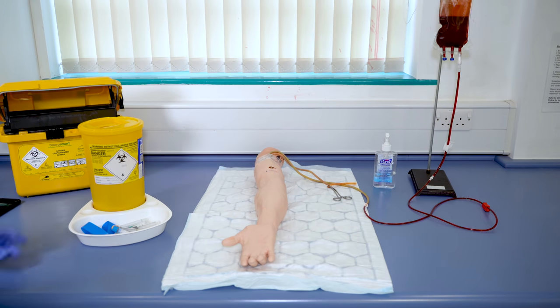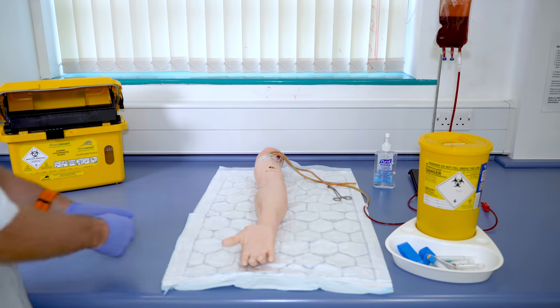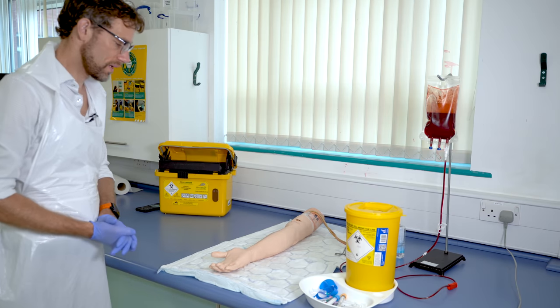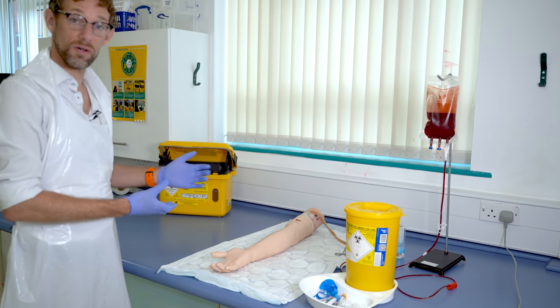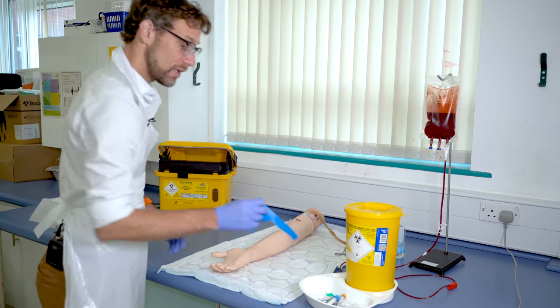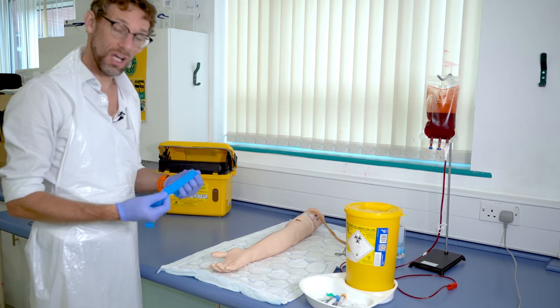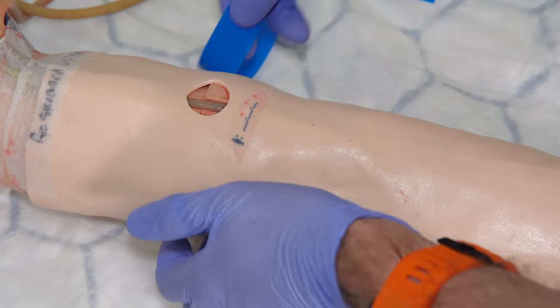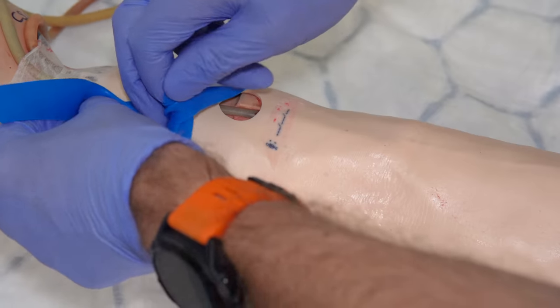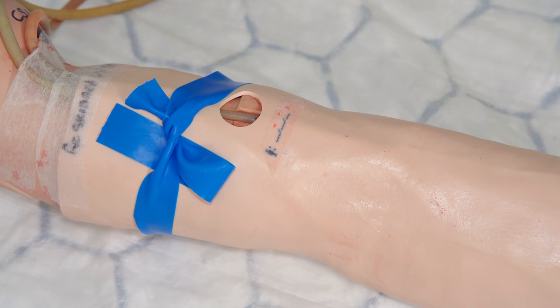As somebody who is right-handed, I want to make sure I'm placing my equipment on the right side of the patient so I'm not having to cross my arms over when doing the procedure. Approaching the patient, we need to introduce ourselves and confirm the patient's name and date of birth, and make sure they're happy for us to do blood today. Ideally we want to go with their non-dominant hand in case there are any problems or discomfort afterwards. We're going to start off with the tourniquet — applying it to the patient's arm with a simple loop rather than a knot, so that you can easily release it with one hand.